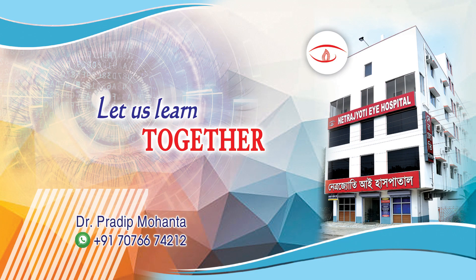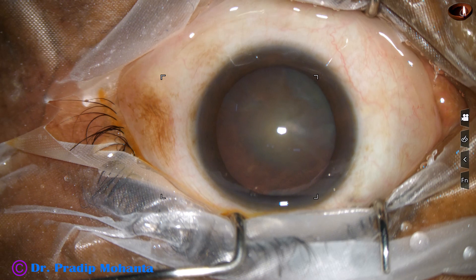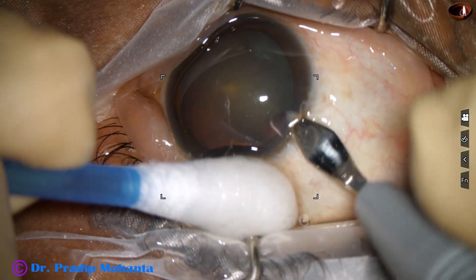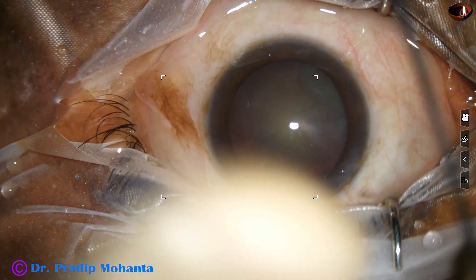Friends, welcome to my workplace at Ranaghat, West Bengal, India. In this video, we are going to see management of this cataract. This is a soft cataract with grade 2 plus nuclear sclerosis. This is the main incision with a 2.8 mm steel keratome at mid-limbus.